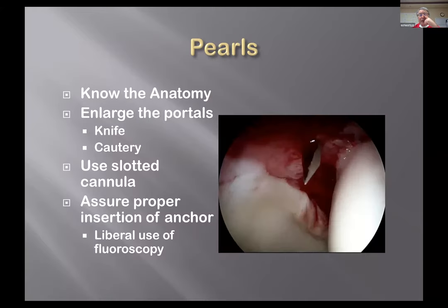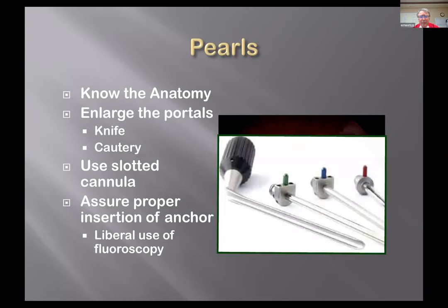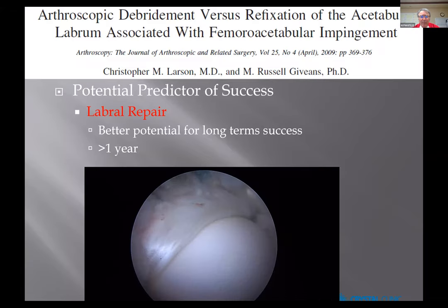I don't use a lot of knotless anchors. I do more on the ones with acetabular rim resections where I've got a nice view of that acetabulum. So this is why we want a good labrum. It gives you a great seal. That's a happy looking hip. Hopefully you've refixed the anchor, the labrum.